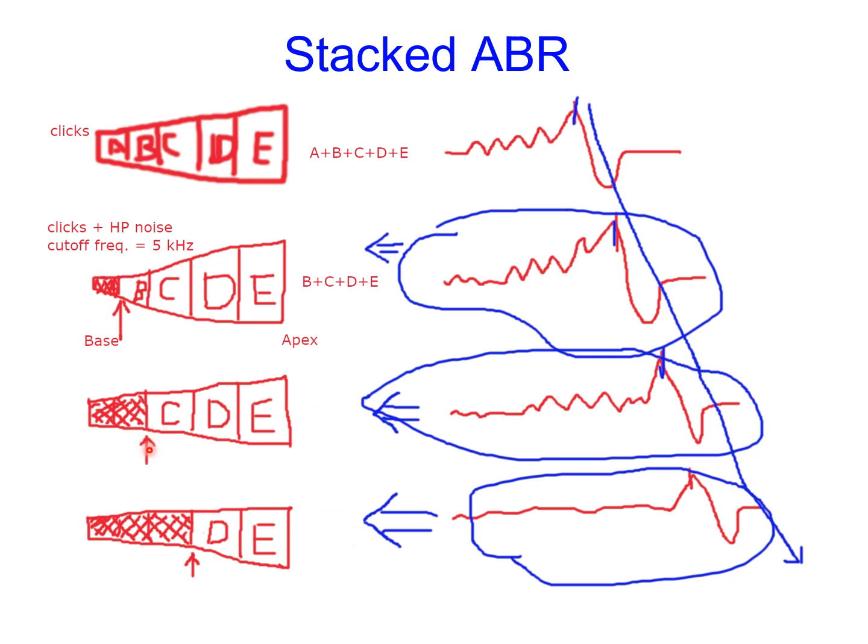In this third condition, only the C, D, and E regions can contribute to the ABR. We get another ABR, and say we have wave 5 here. This time the ABR latency is determined by cochlear regions more toward the apical end because of the change of the cutoff frequency.